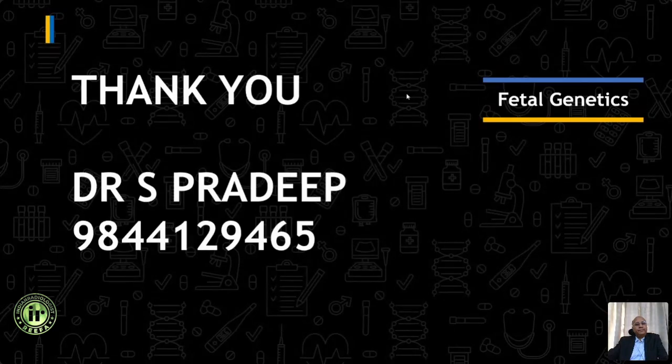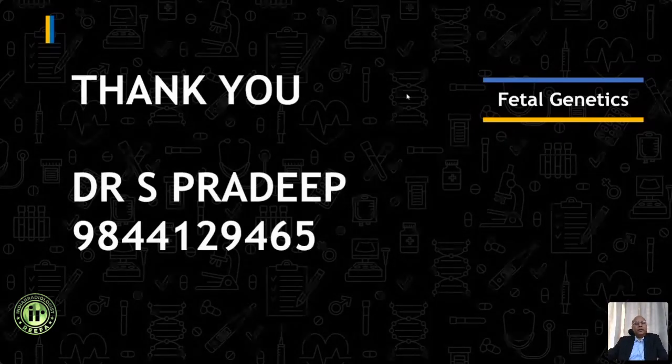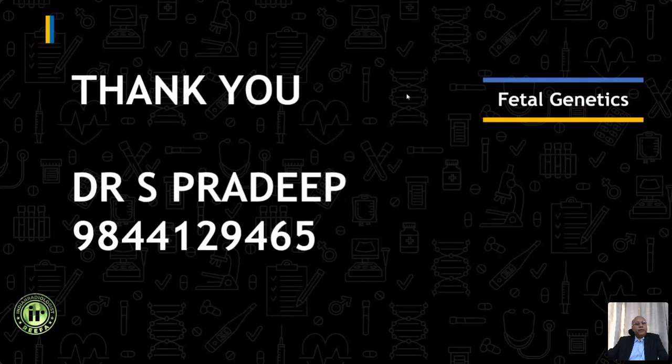Okay, thank you, sir. Bhumika is asking, is tricuspid regurgitation only a risk marker in the first trimester scan and not in the anomaly scan? If yes, then why? As far as tricuspid regurgitation is concerned, in the first trimester, we can look at detecting whether it's there or not. It is a marker both for aneuploidy and for cardiac anomalies. So we do not really jump and do anything when there is an isolated tricuspid regurgitation in the first trimester.